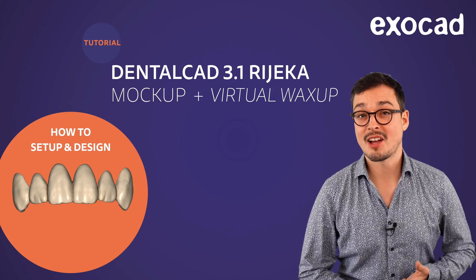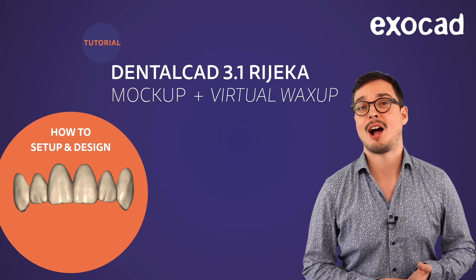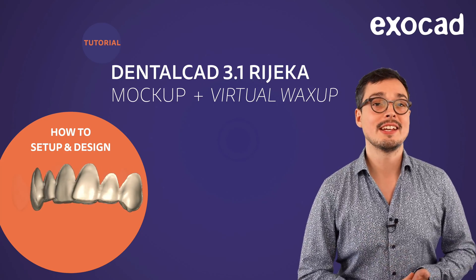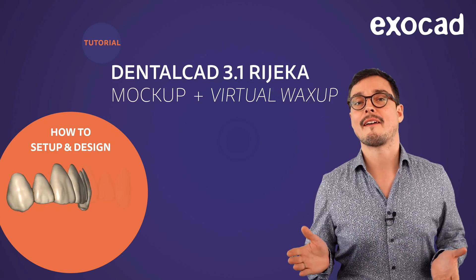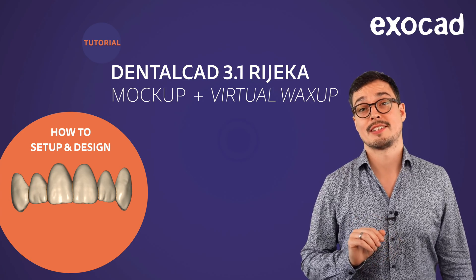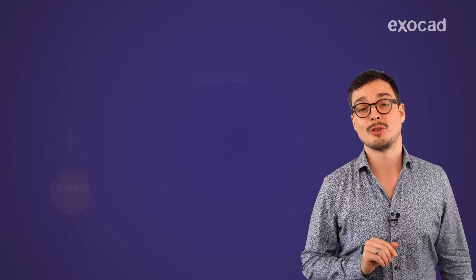Hello, I'm Clemens from exocad. Welcome to this video tutorial. Today you will learn how to set up and design a mockup. All you need is the core version of DentalCAD Galway, Rijeka or higher. No further modules are required. Before we start step by step, let's talk about the new possibilities this indication has to offer.